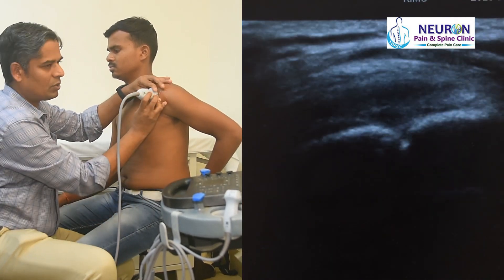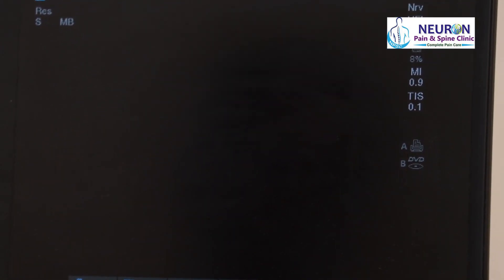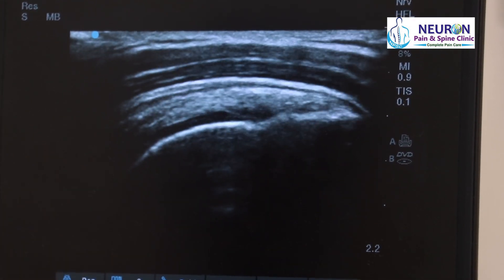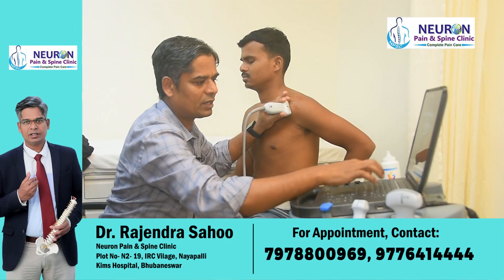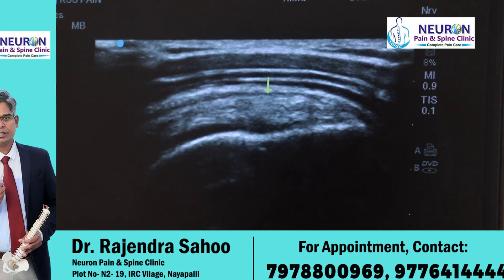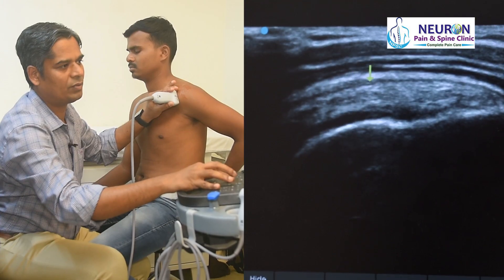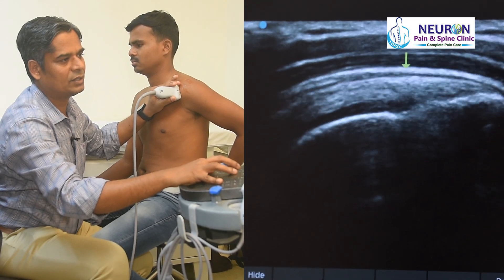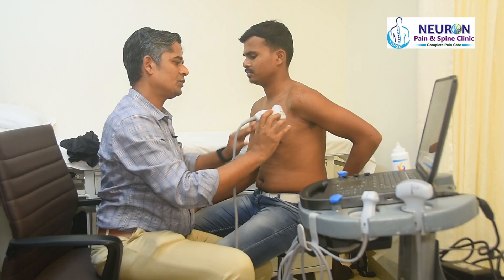In this image, at the top is the deltoid muscle. This is the bursal surface and this is the articular or insertional surface of the supraspinatus tendon. There is a small hypoechoic line — that is the subacromial bursa. On top of that there is a hyperechoic line, which is the peribursal fat pad. This concludes the long axis scanning of the supraspinatus tendon.